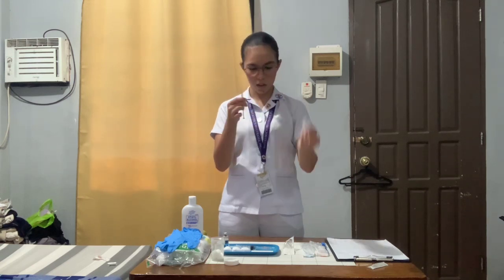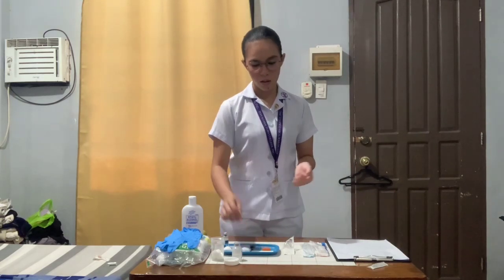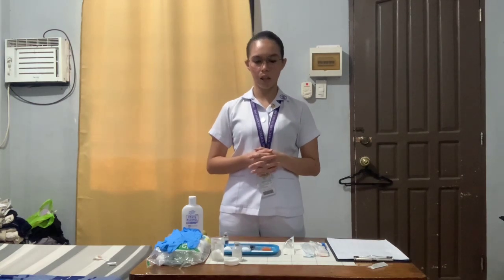Okay, so after that, we are now going to cap back the syringe. So now this is ready, we are also going to put this in our hypodermic tray. So after preparing all of the medications, we're now going to proceed in meeting our client and verifying our client.